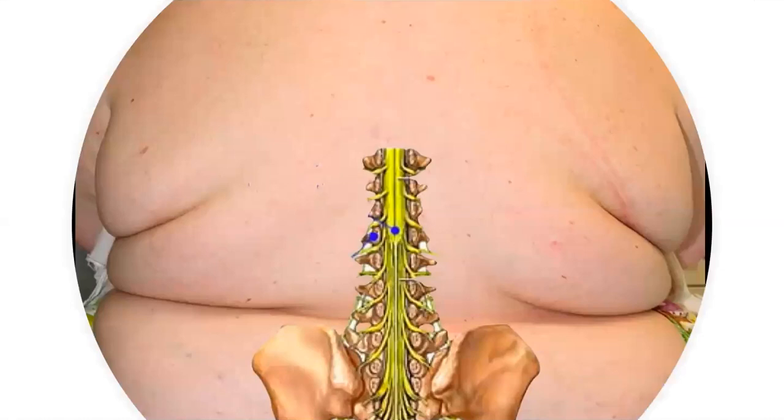As you can see, palpating these iliac crests in this morbidly obese patient will be particularly difficult, and one will really struggle to find the interspinous spaces.